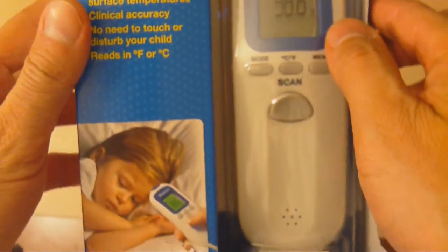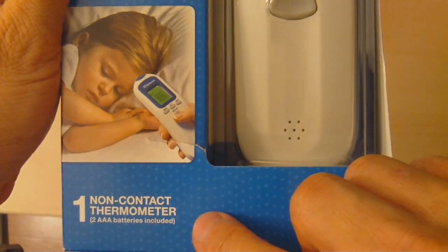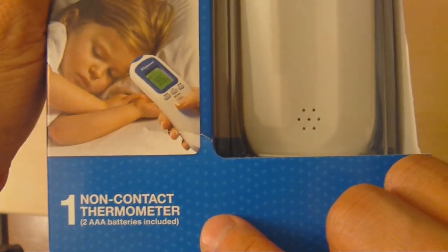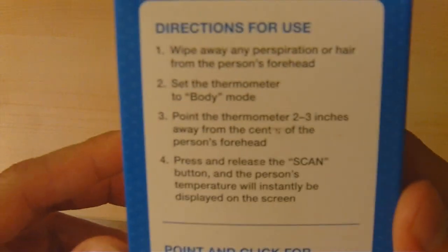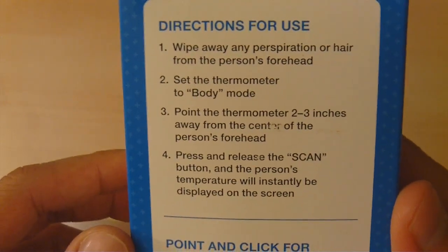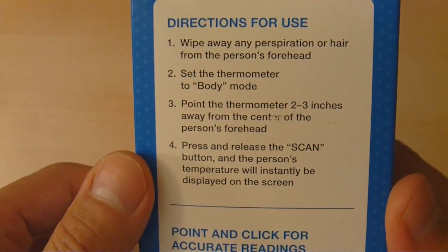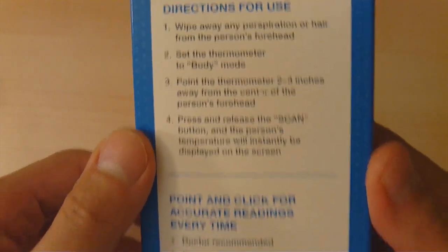It seems pretty powerful, especially since you don't need to touch. No touch means no contamination. It requires two AAA batteries, which are included according to the box. On the side it tells you the directions for use: first remove any perspiration or hair from the person's forehead, set the thermometer to body mode, and point it to three inches from the center of the forehead. Press scan and the person's temperature will be displayed on the screen. Sounds pretty simple.